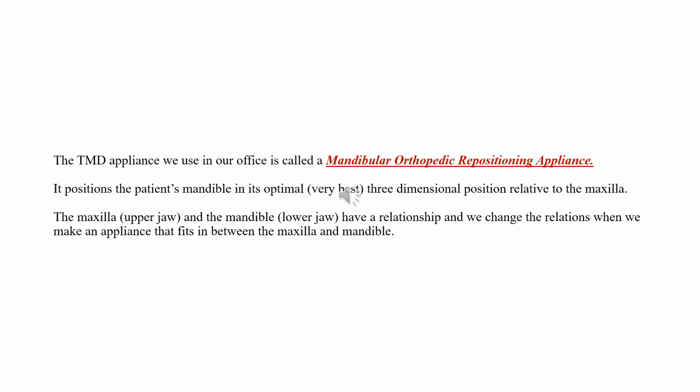We're learning words and phrases and the terms of things, so it's important to know that the TMD appliance we use in our office is called a mandibular, lower, mandible, orthopedic, having to do with the relationship of bone against bone, repositioning appliance. It is called the Mandibular Orthopedic Repositioning Appliance, abbreviated MORA, M-O-R-A.